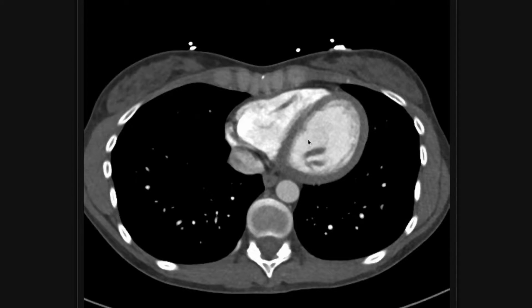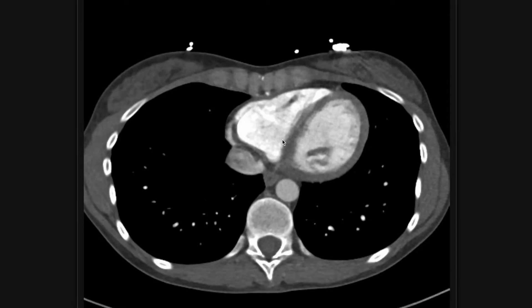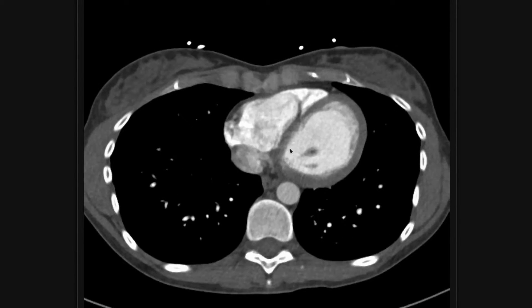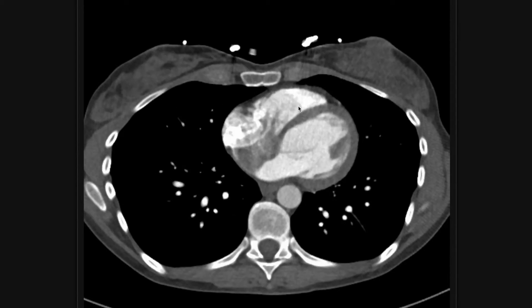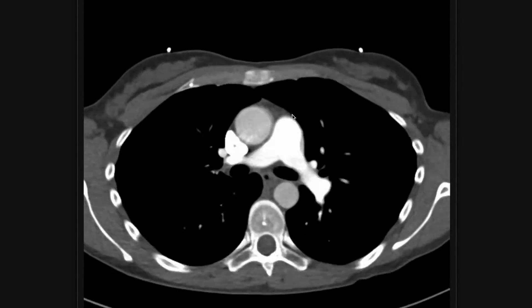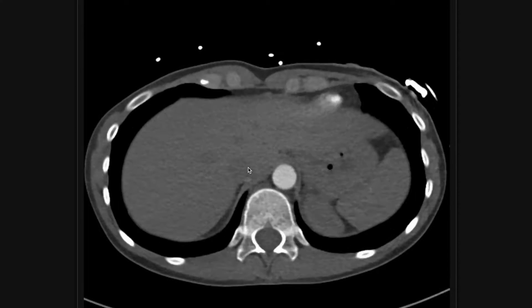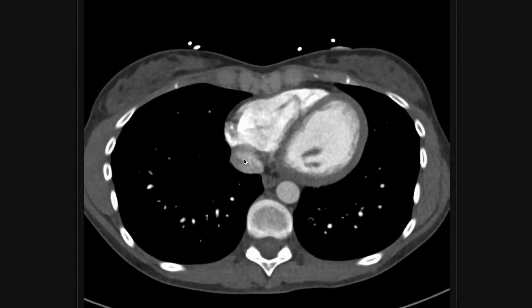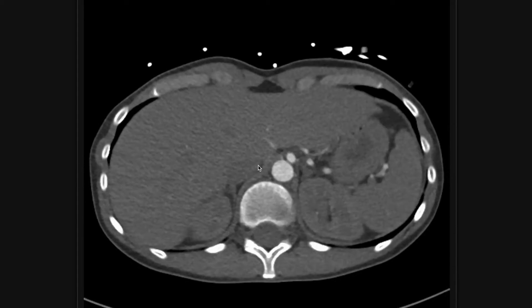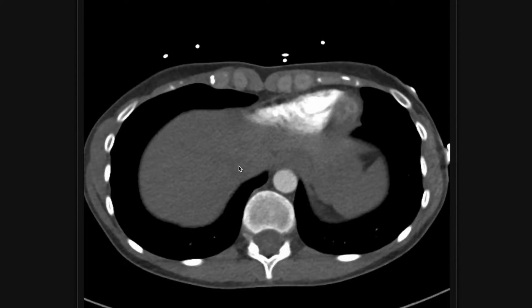Something to always keep in mind with pulmonary emboli: if you see one, the next question is whether there is right heart strain. One of the first imaging markers is flattening or bowing of the interventricular septum — if it's flattened or bowed towards the left ventricle, that could be a sign of right heart strain. Similarly, if the right ventricle is really dilated, that's another finding. And if there's contrast reflux into the inferior vena cava, that suggests the right heart is failing.